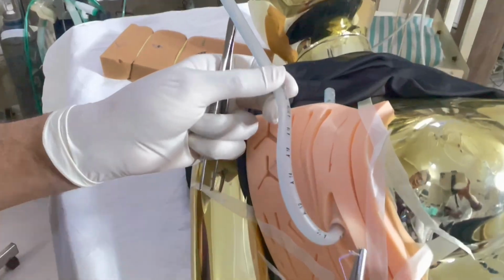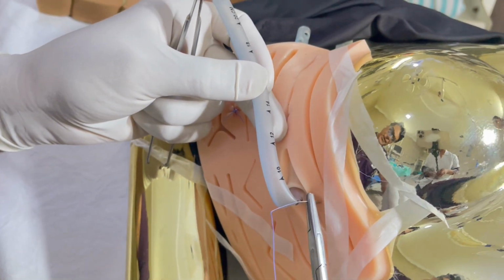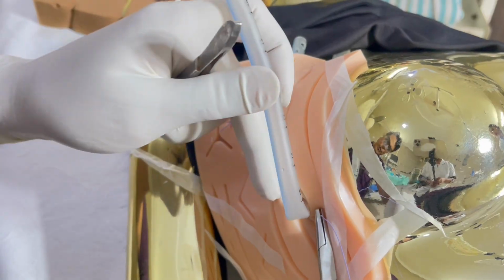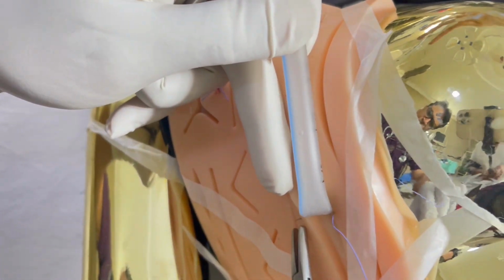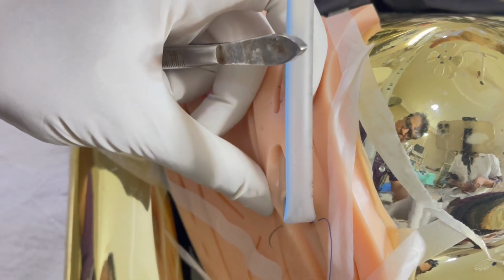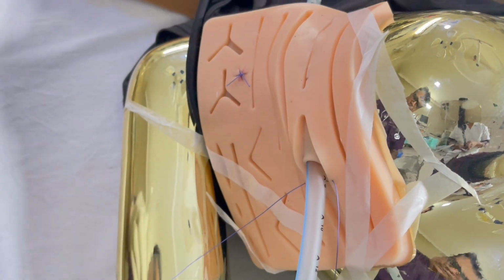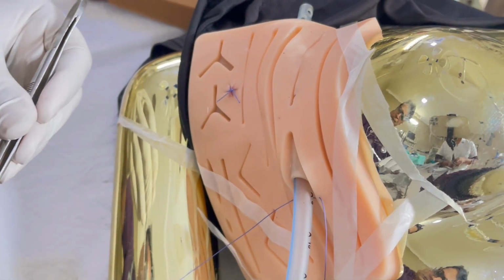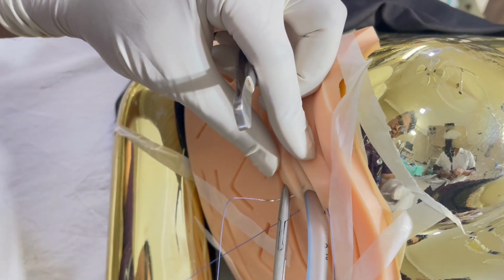There are different methods. One is you just take a horizontal mattress. So you take a suture below the drain, then this is the horizontal mattress.